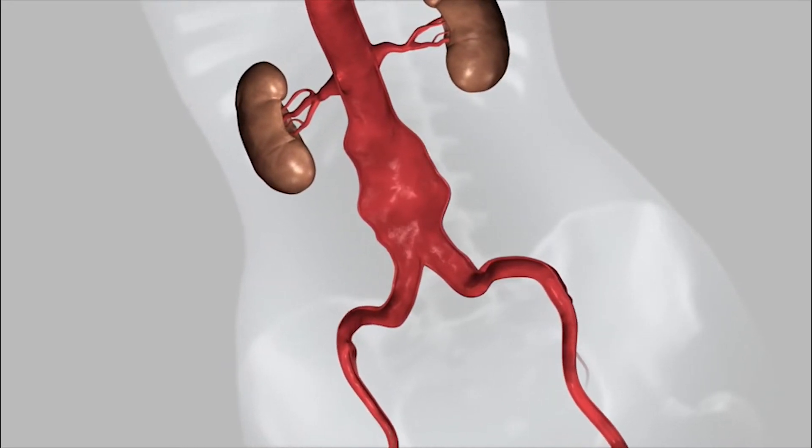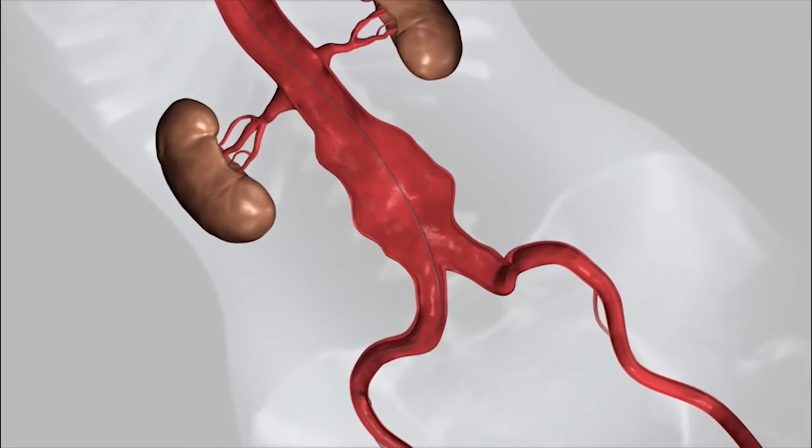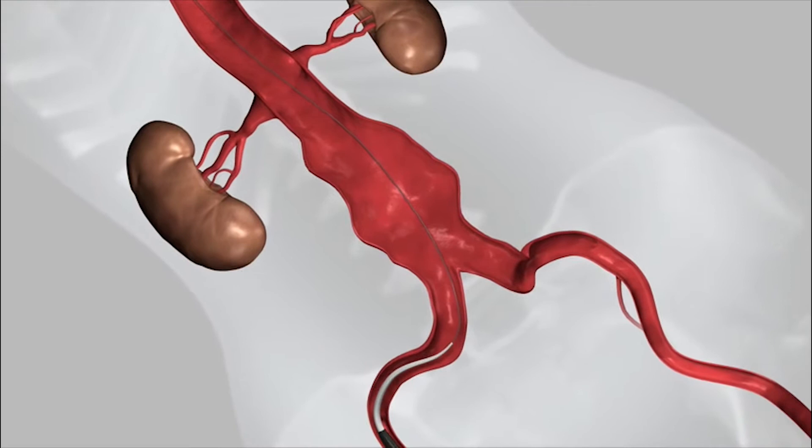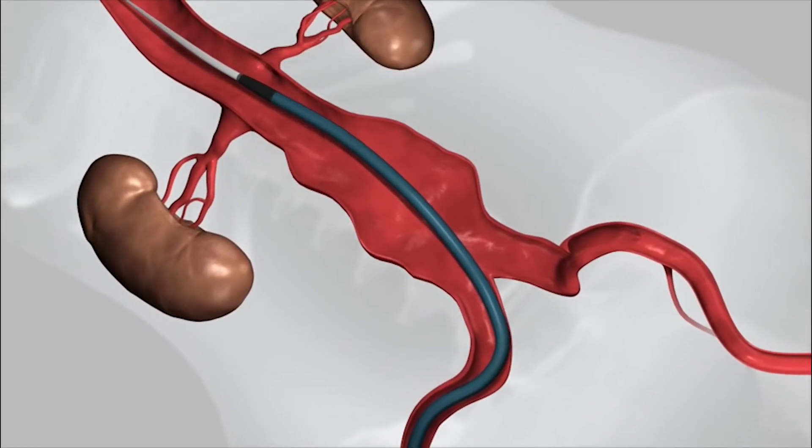To repair the aneurysm, a wire is being inserted from the artery in the groin called the femoral artery on the left side of the screen. The wire helps guide the device inside the blue catheter you can see moving upwards.